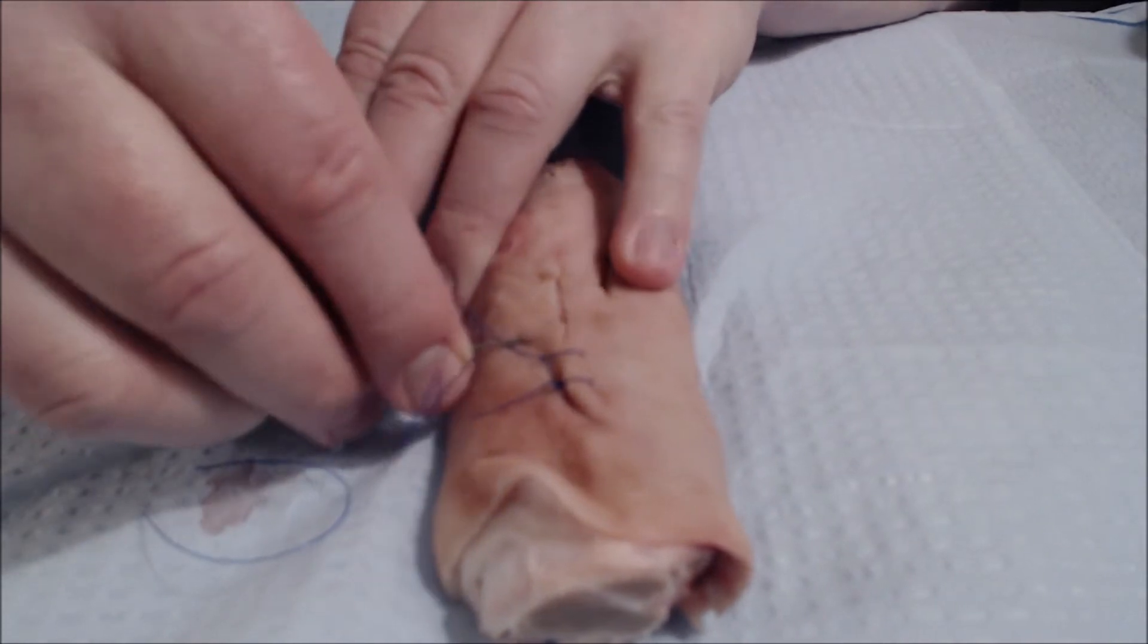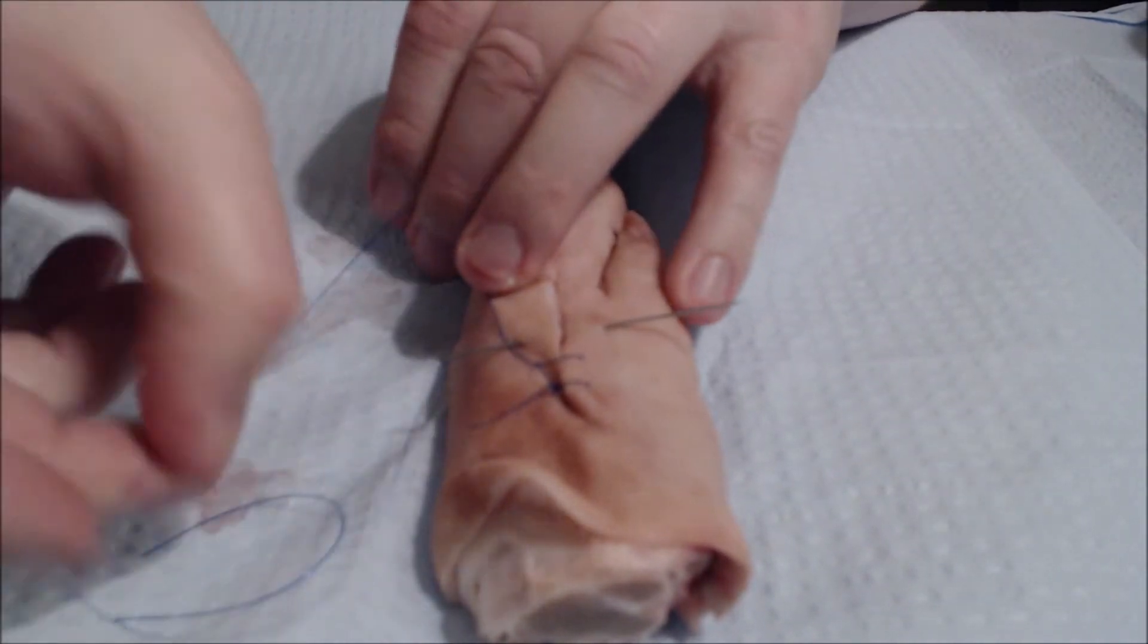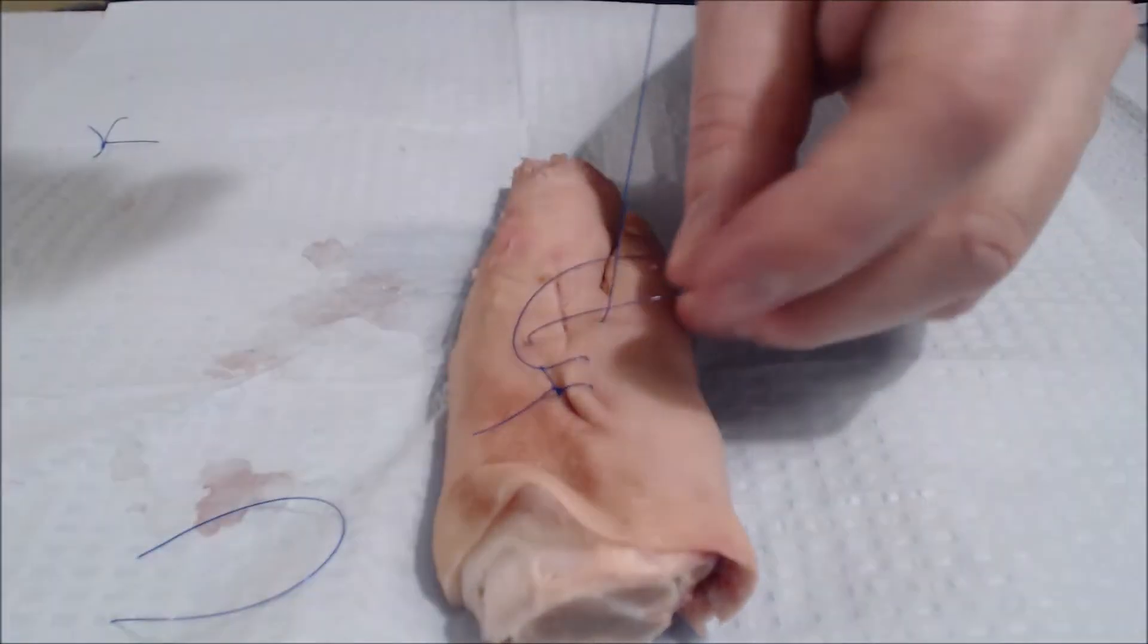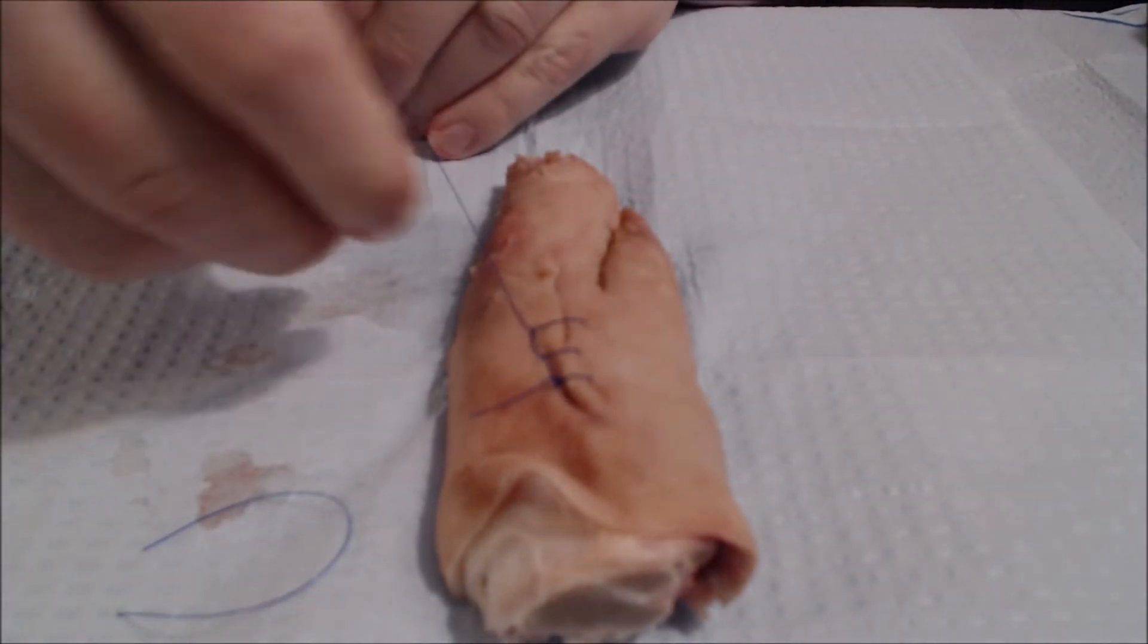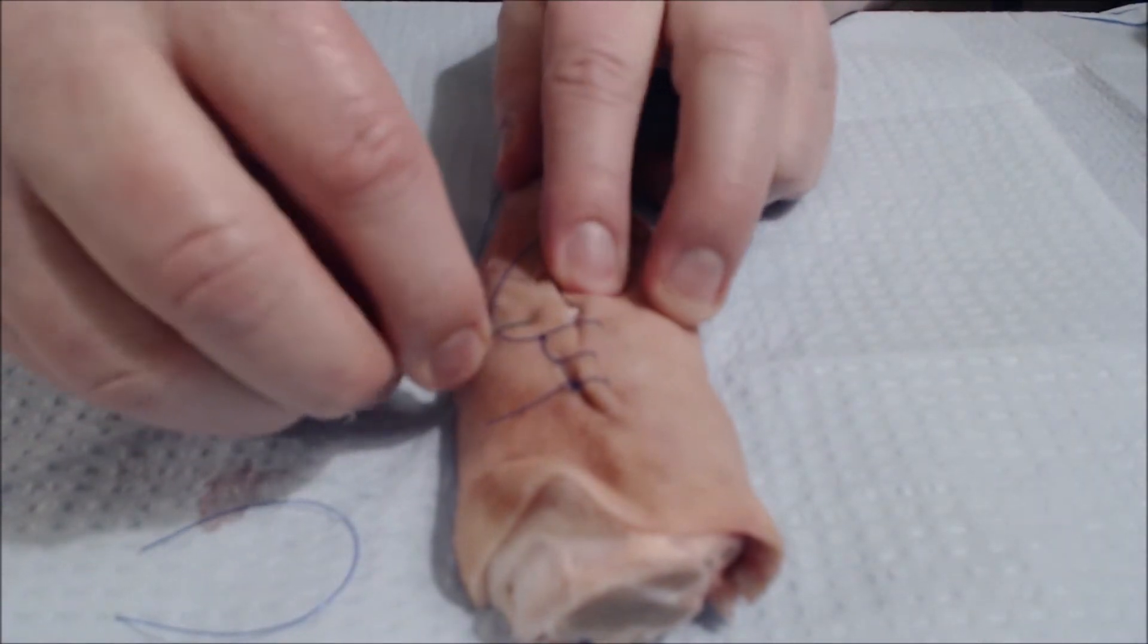Another one. Again, we're going to place the loop of suture over the top of the needle and pull the needle through the loop. You can see that we're just going to march our way down as we did before.